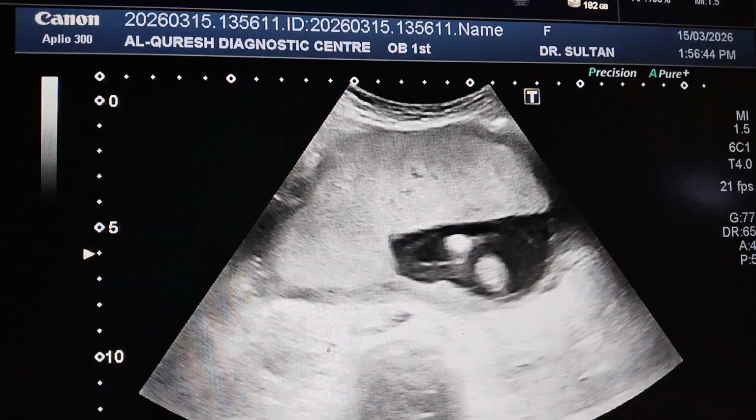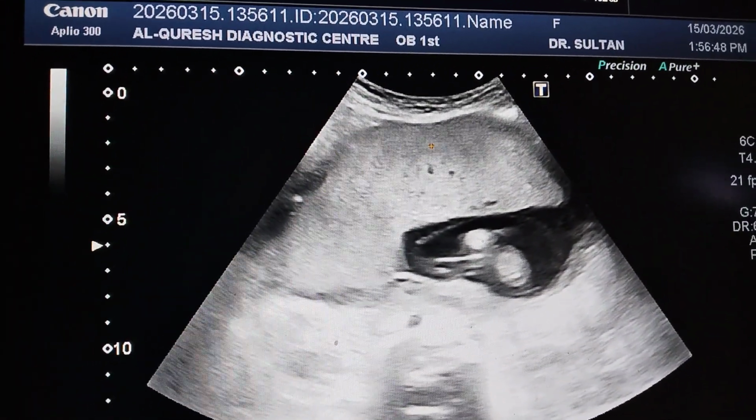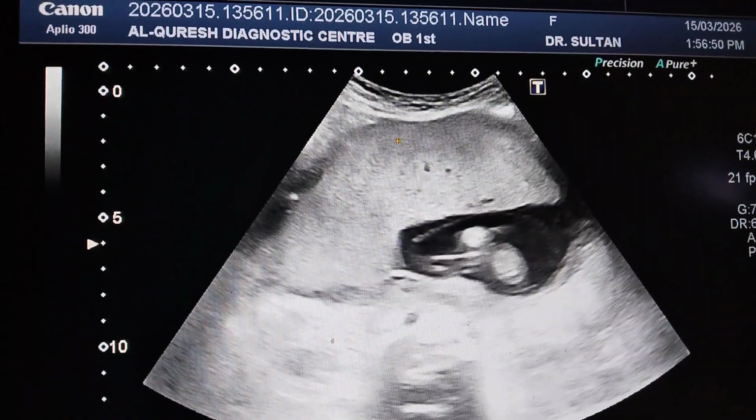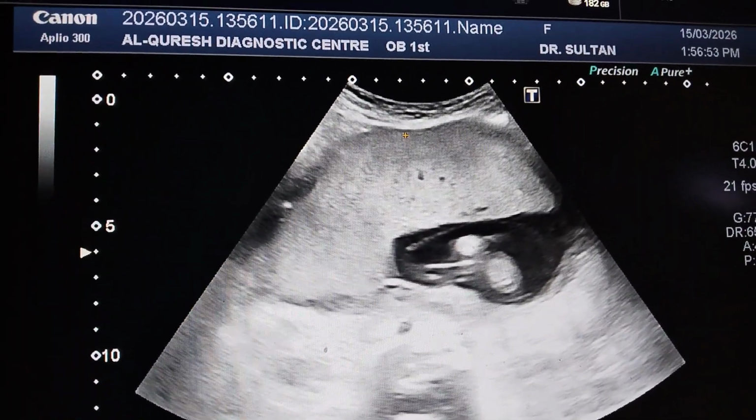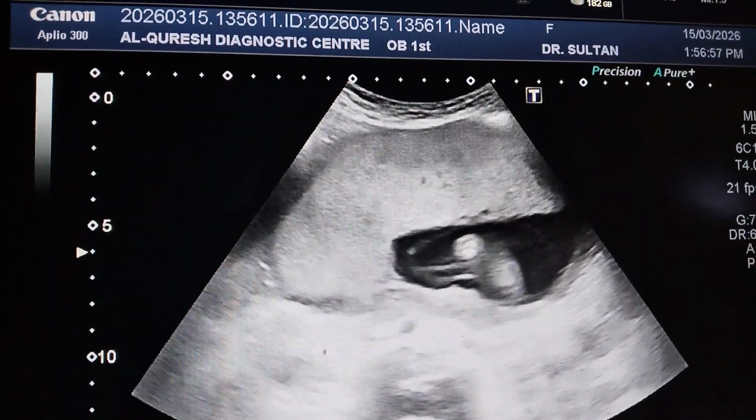Dear colleagues, I am Dr. Sultan Ayub, working as a radiologist. This is a female patient for anomaly scan. So I am going to scan the fetus.